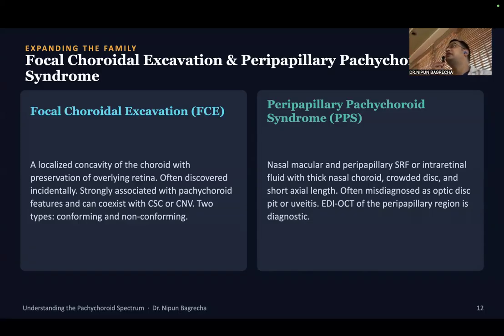And one more entity described is the pachychoroid vitelliform maculopathy, where we see the vitelliform material. We had one patient who had bilateral 6/9 vision, and he was given injection elsewhere, but the OCT picture and the vision were the same bilaterally.